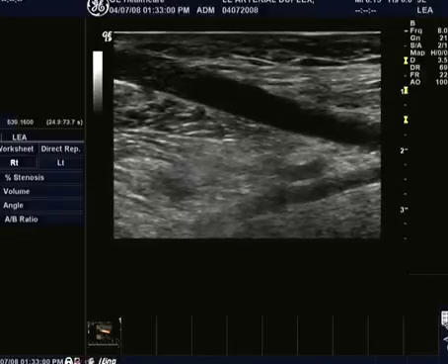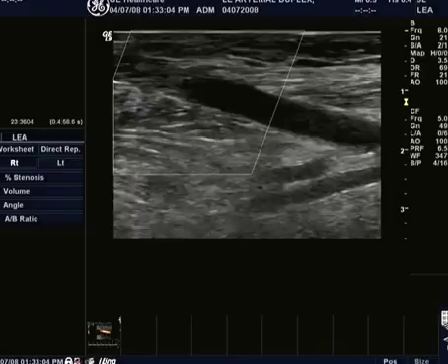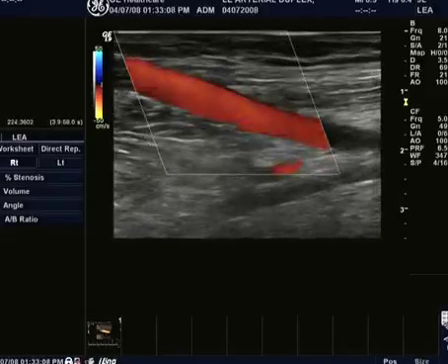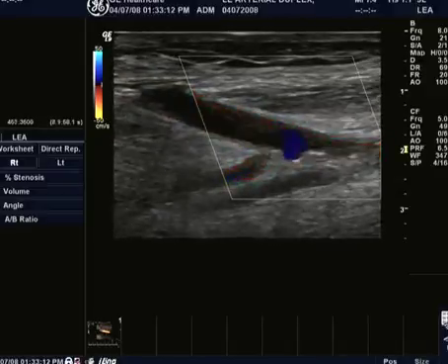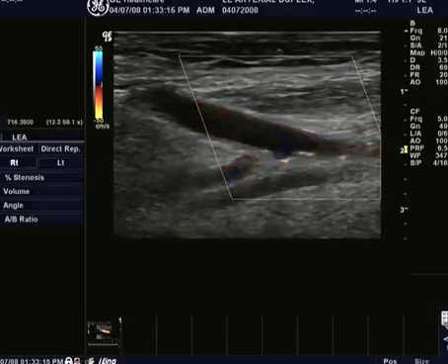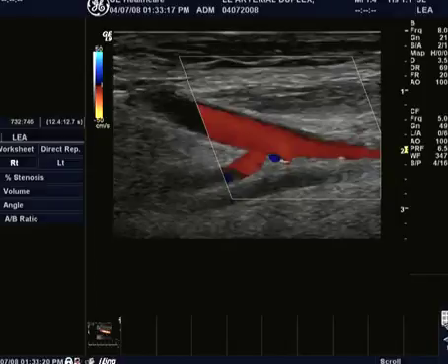And here we see our bypass curving away. Now here I'm going to show you some color at this point, because I think this is helpful following it down. And one thing we can see right off the bat is this beautiful anastomosis. And let me just freeze that for a second and scroll back and talk about this just for a second before we get too much further.